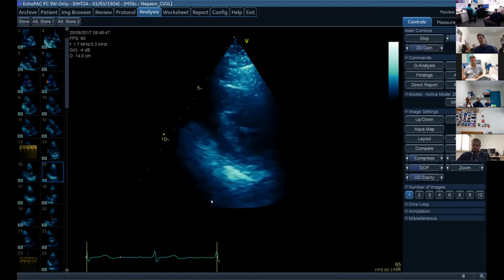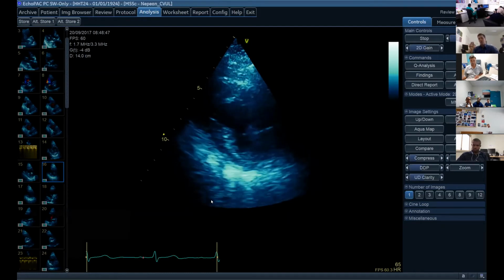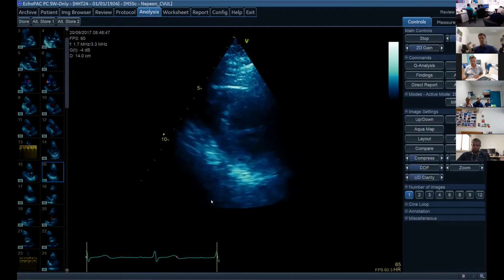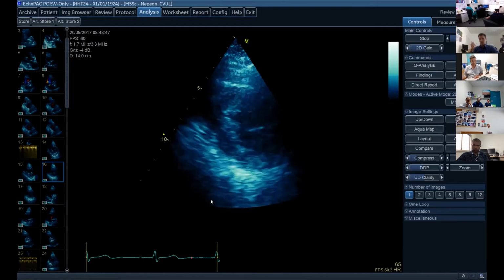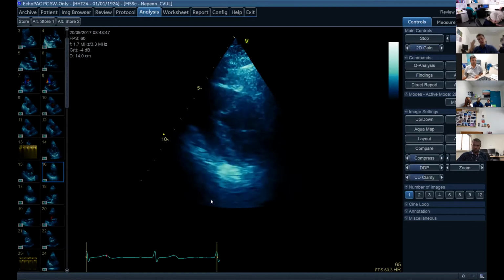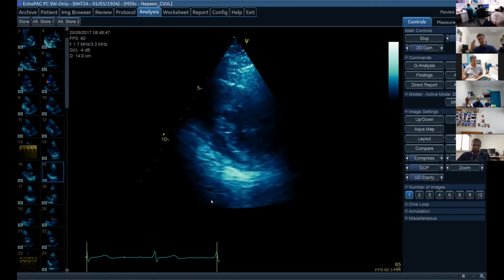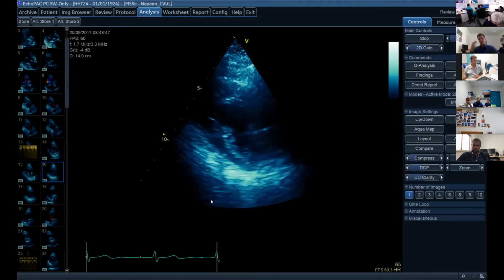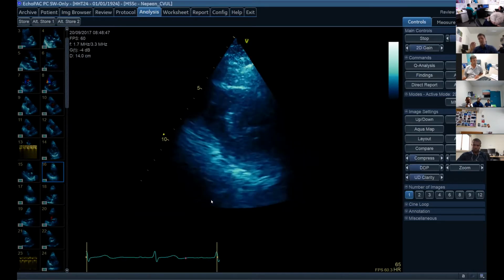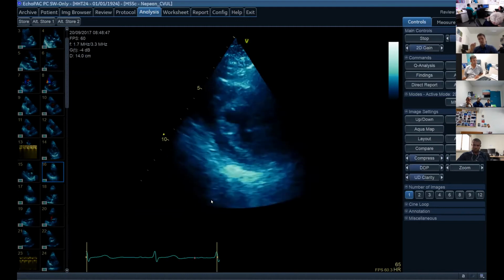Ramsey, Ravi said right at the beginning that we've got a thickened LV with hyperdynamic function. He also said that if you're seeing abnormalities in this plane, we want to have a look at it in another. So this is the picture I want to show you to make you think that I was not off axis on that first picture, and to show that we've got a thickened LV but also this hyperdynamic function. With that, I'd want you to start thinking that we've potentially got a cause for the hemodynamic instability of this patient, in the fact that we're potentially underfilled.